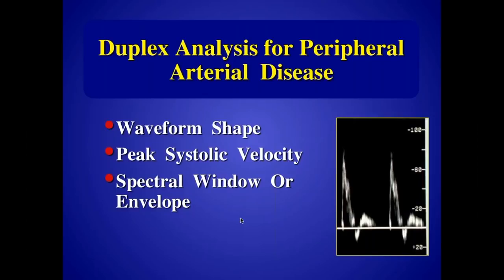And it could be up higher, it could be 120 or so, it might be a little bit lower, but this is an average. As we move down the lower extremity, the velocities are going to decrease. At the level of the popliteal arteries, it's about 60 to 80 centimeters per second. And as we move then down further into the tibial branches, it's about 40 to 60 centimeters per second. So make sure you jot that down. Have this as a handy reference when you're looking at peripheral arterial studies, because the velocity measurements should be within these ranges for these particular vessels.